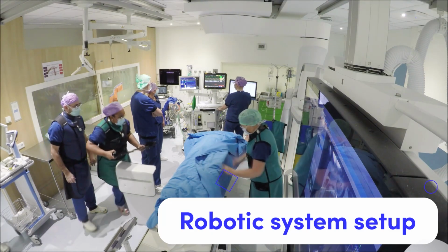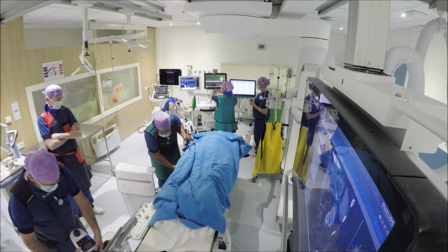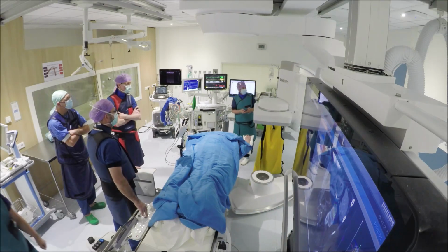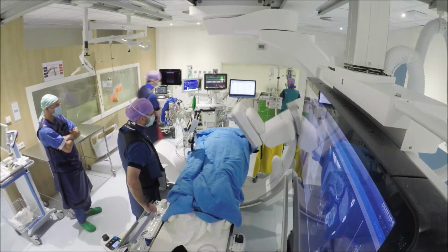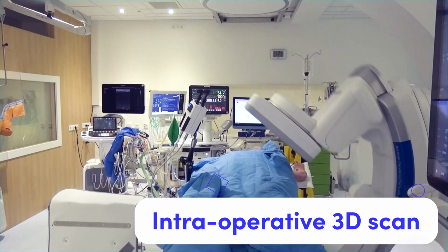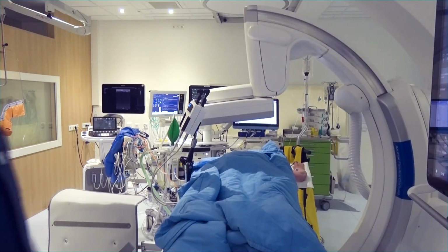After arriving in the intervention room, the patient is put under general anesthesia, transferred to the intervention table in a prone position. We then install the base plate for the robot and attach the robot. Then we bring in the C-arm and we start with the preparations for the first CBCT acquisition. The planning CBCT acquisition is used for segmenting the tumor volume, for planning the different needles, and also for fusing it with the previously acquired conventional CT scan images.